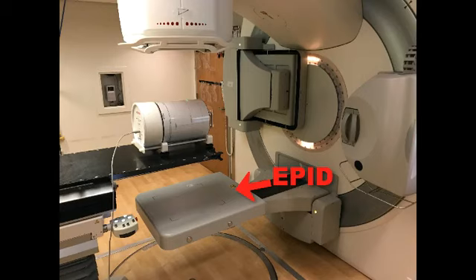There are some challenges to this, because in turning that image into a dose, it's complex. You have to correct for scatter, you have to correct for energy response in the detector and other effects. So it's a bit of a work in progress still, but this is one direction things are going, and the advantage is that you have a very high resolution image. The EPID is sort of similar to film in its resolution.